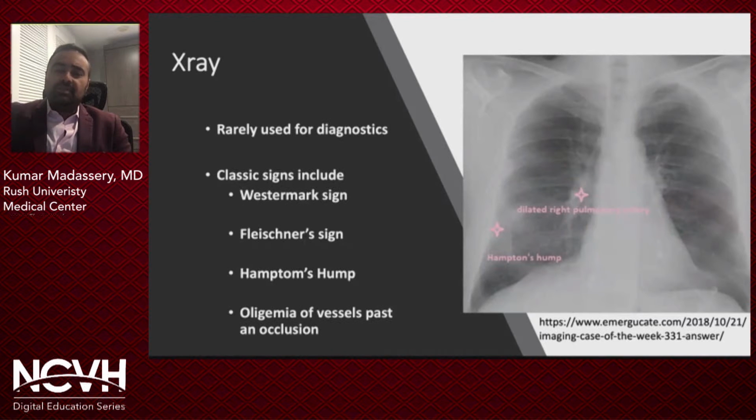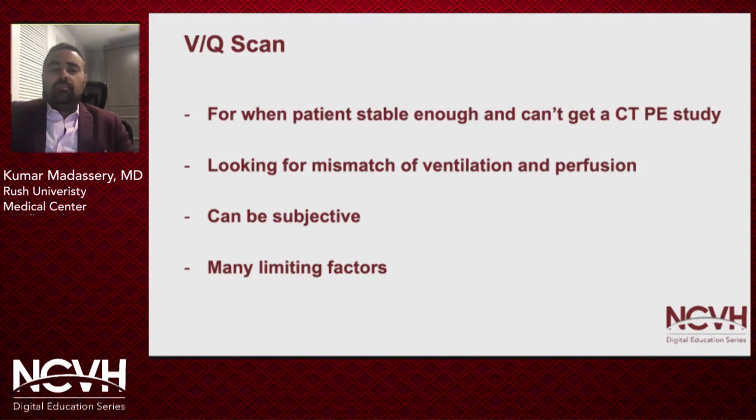Most every patient nowadays will get a CT scan. The VQ scan, ventilation perfusion scan, is done in the nuclear medicine department at most institutions. It's a little bit of the bane of the existence of some radiologists because we don't like reading these personally, because we have other modalities. However, we do have a small subset of patients that have a difficult time getting a CT scan, whether it be holding still, IV access, or contrast issues, kidney failure. So there is some value to this type of imaging, albeit it takes longer.